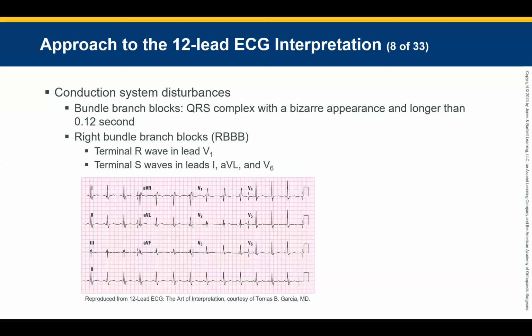We're in a bundle branch. Okay? Greater than 3 small boxes, we call that a bundle branch. Remember, we already had something we were measuring with, if we have P waves, right? So our underlying rhythm is what, first of all? Everybody think, deep breath. Our underlying rhythm is normal sinus rhythm. It's not a ventricular rhythm. We don't say it's a bundle branch when it's idioventricular, because there's no P waves. The underlying rhythm does not match. Does that make sense? It's not already a wide rhythm.